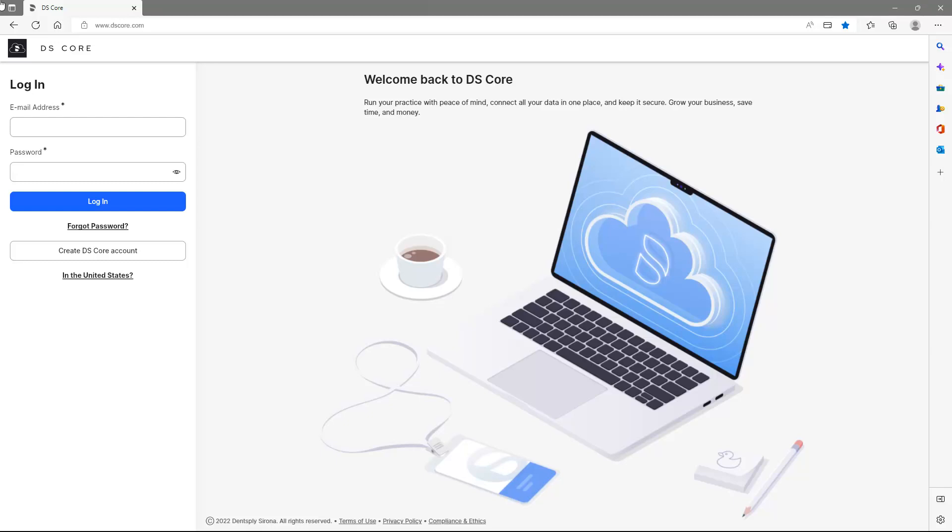The first step is to go to dscore.com on a web browser. We recommend that by registration, you are connected to your practice network so that you can continue right away with connecting your devices. If not, you can always do this at a later stage.